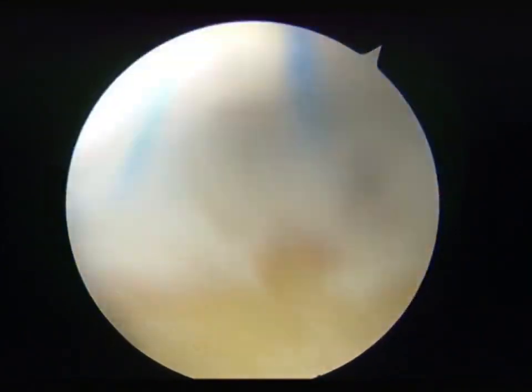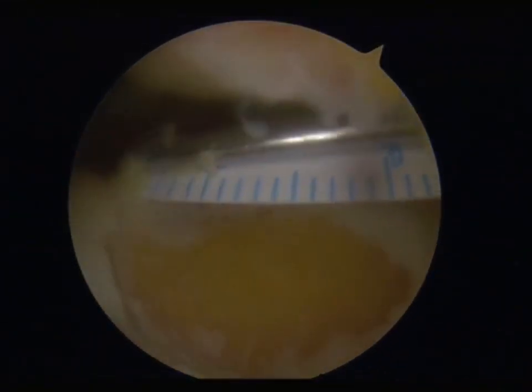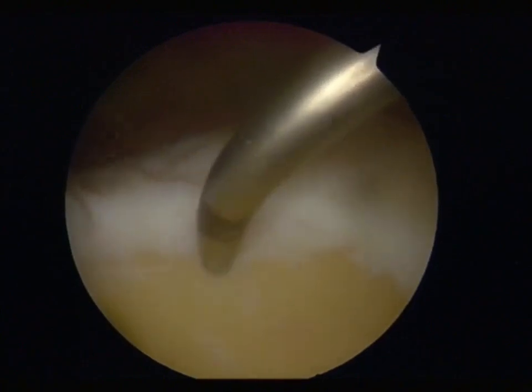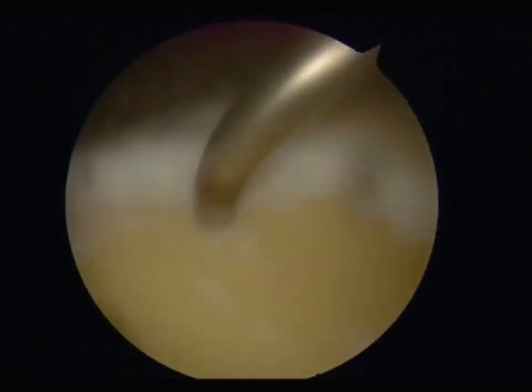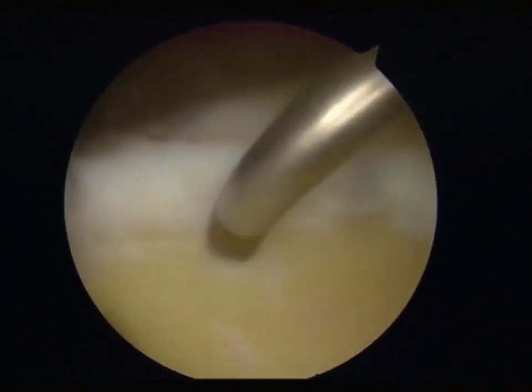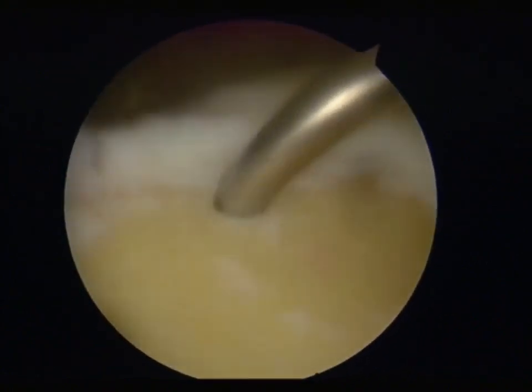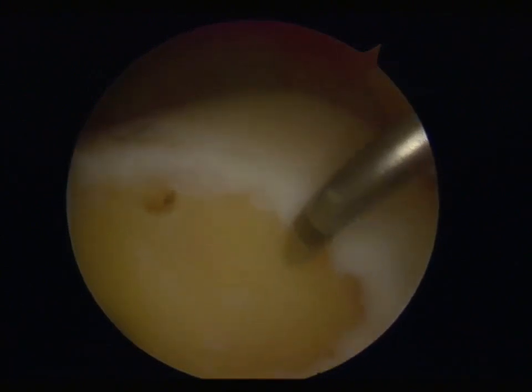Measure the area of the defect under arthroscopy with a ruler to prepare for subsequent implantation of the porcine peritoneum. After determining the area of the defect, microfracture was performed with a depth of 3 mm and a diameter of 2 mm, using a microfracture instrument with a spacing of 3 mm in the area, allowing some bone marrow and blood to seep out of the holes.